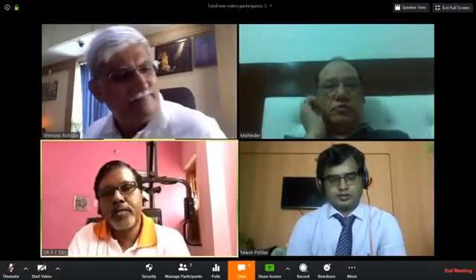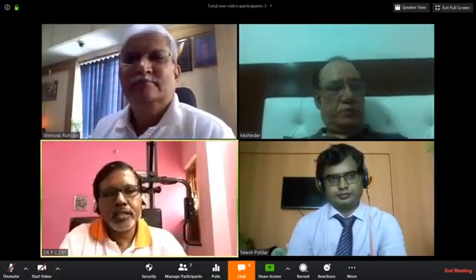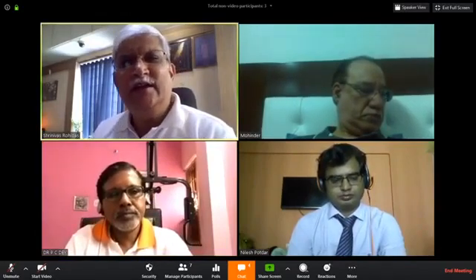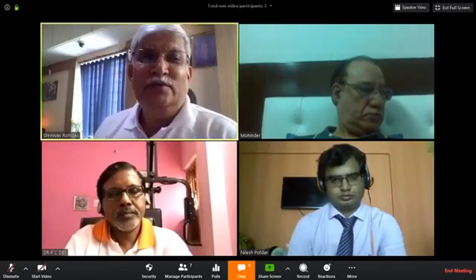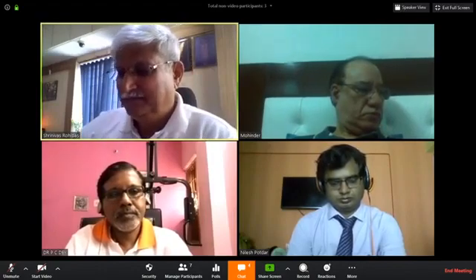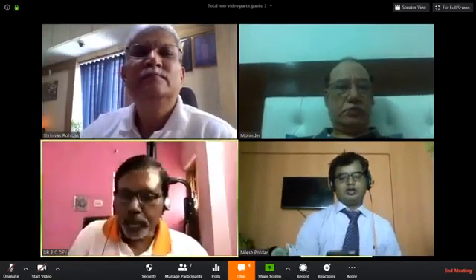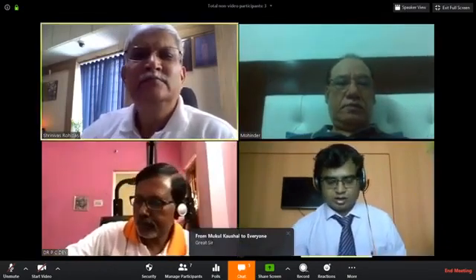Disc removal, most of the time you should avoid it because it may add to the listhesis again. That is what I added in cases of UBE technique. The opposite exiting root is nicely seen and nicely decompressed. That is one of the advantages I saw in UBE technique. So no need for disc removal. Nilesh, any question left? Yes, sir.